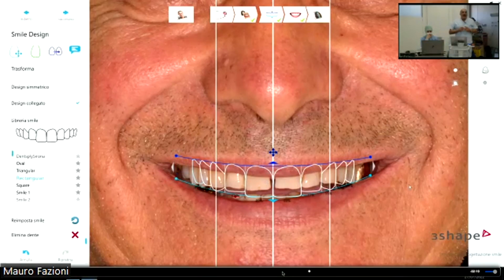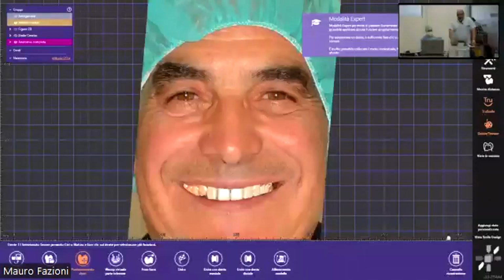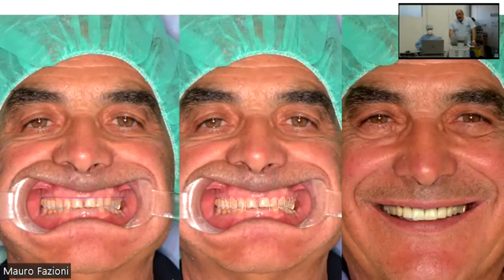So in our hospital, we have set a technique called additive bite solution, where we can set the dimension of the teeth that is seen in the right photos. The patient is very happy with this possibility.